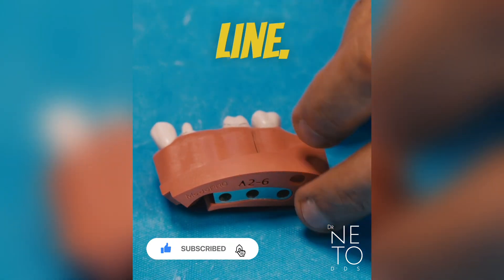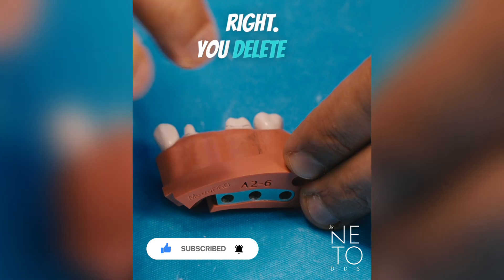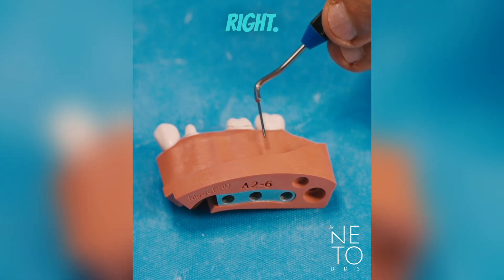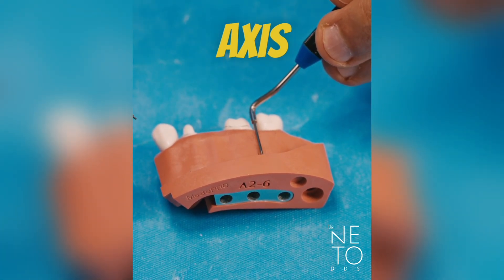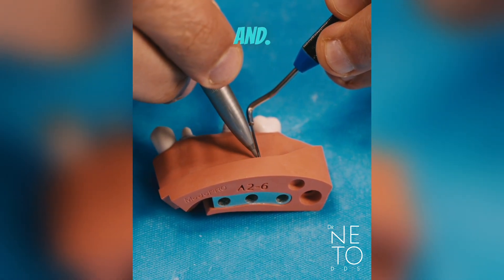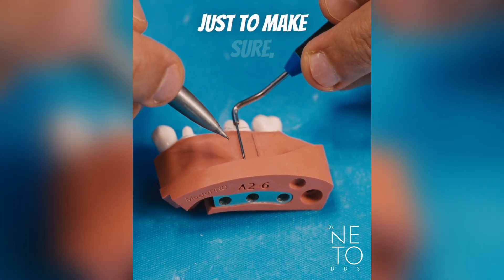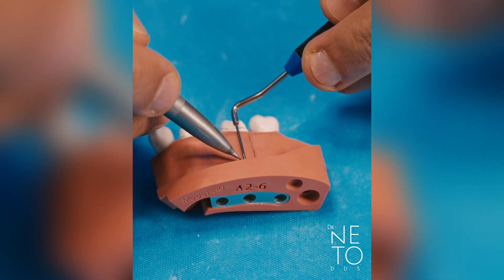If you feel that the line moved and it's not right, delete it and try again. Take your time to do this. Make the line as long as you can, because if you make short lines you lose your reference.